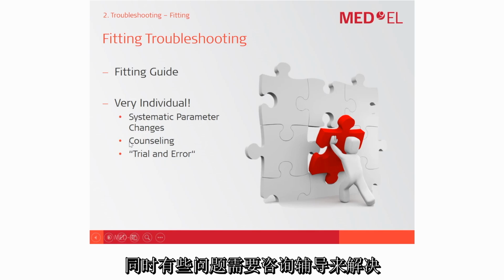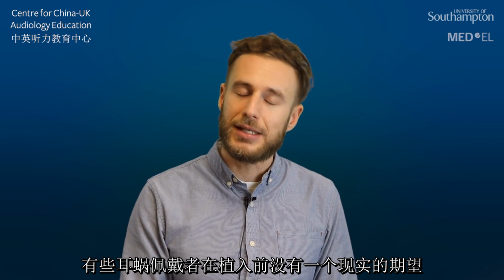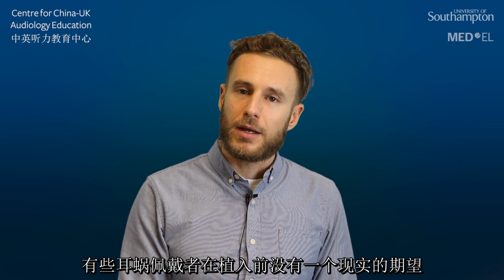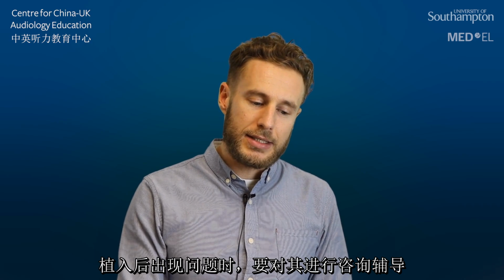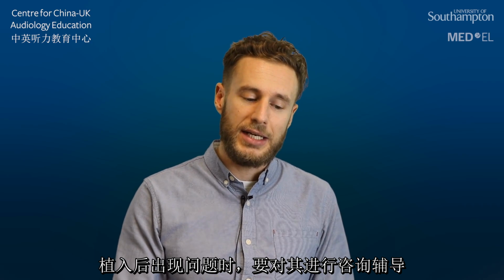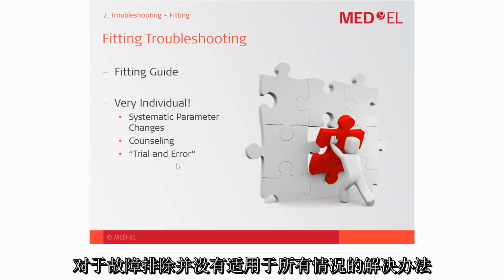Some aspects are also related to counseling. Some CI users don't have realistic expectations before they are implanted with a cochlear implant. And in many problem situations, you really need to follow a trial and error approach. We can't provide a systematic troubleshooting guideline for each and every situation.